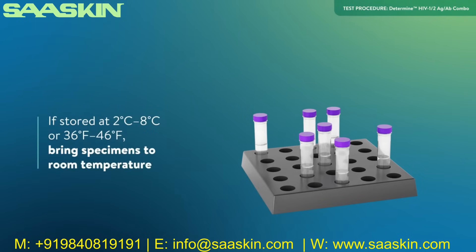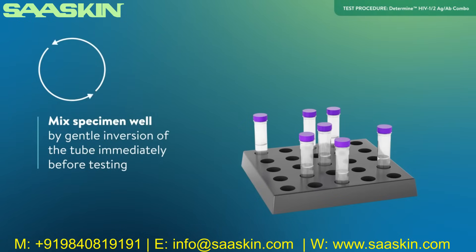Do not freeze whole blood specimens. If stored at 2 to 8 degrees Celsius or 36 to 46 degrees Fahrenheit, bring specimens to room temperature before testing. Mix the specimen well by gentle inversion of the tube immediately before testing.